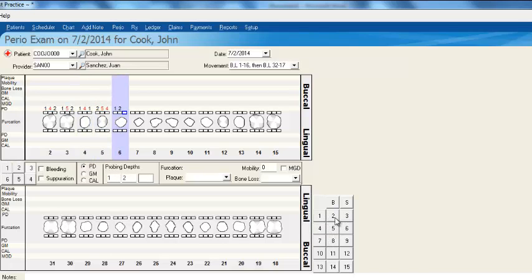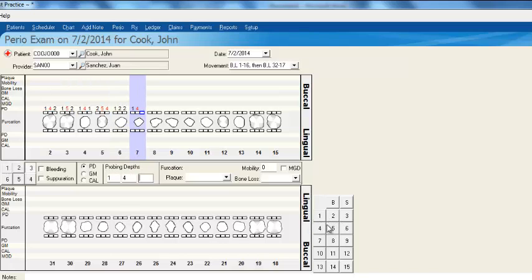If you have a tablet PC, this will work wonderfully — you can go ahead and use a tablet to enter in these measurements.